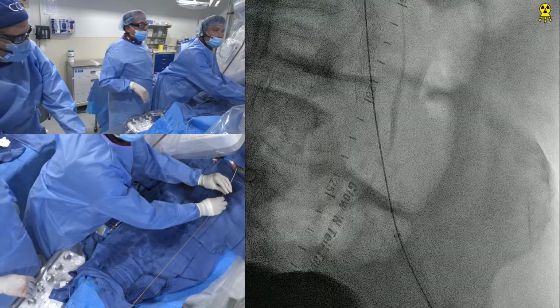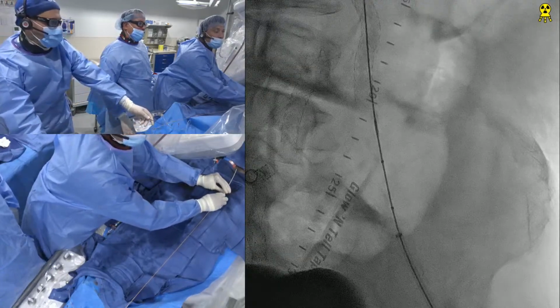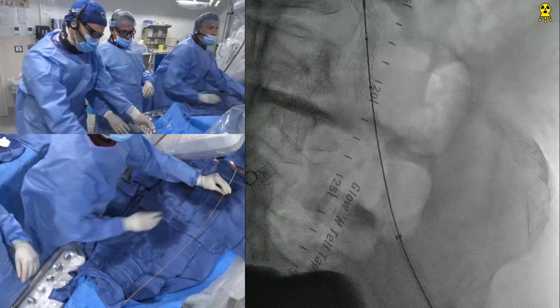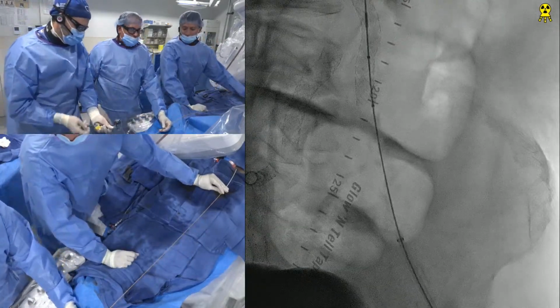Yeah. So at this stage, if I can get good apposition of this stent, this way if the patient has a cardiac cath or another peripheral cath, somebody doesn't get into the struts here, okay? And that's good. Leave it hanging out a little bit. You always want to hang it out a little bit, so this way it wraps up into the aorta. Go for it. And then Luke's going to go up.